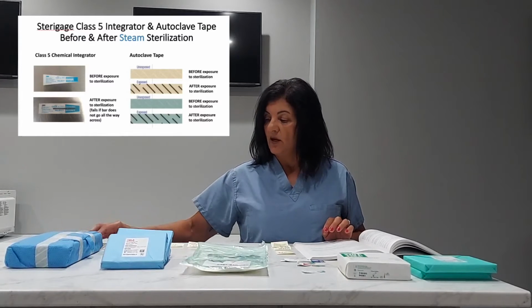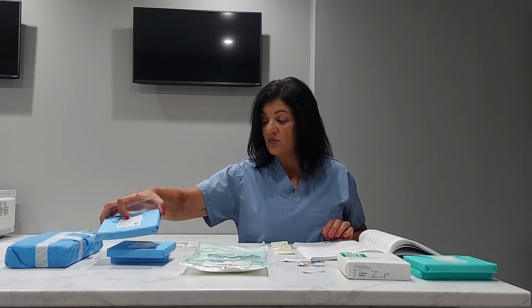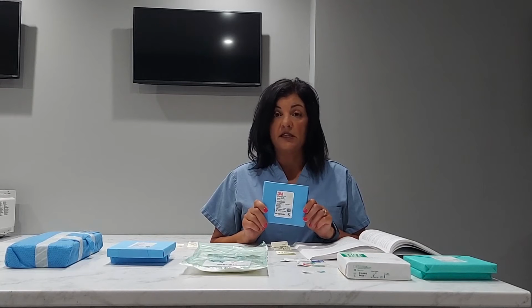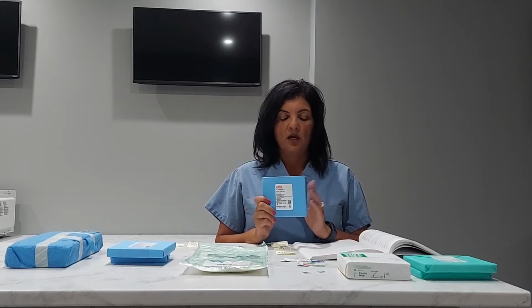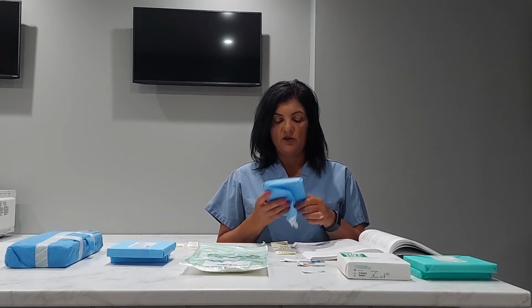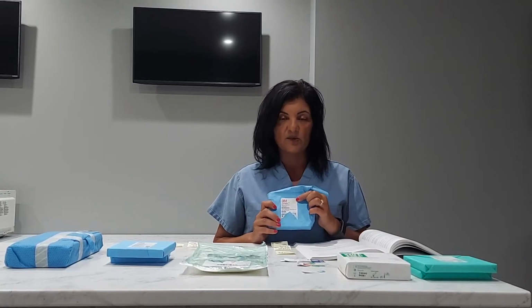The second type of indicator is a class 2, and typically a class 2 is used for specific test procedures. A class 2 would typically be your Bowie-Dick or your DART test. DART stands for Daily Air Removal Test. This is a procedure that is being done in your sterilizer. A Bowie-Dick or DART test is also a process challenge device.